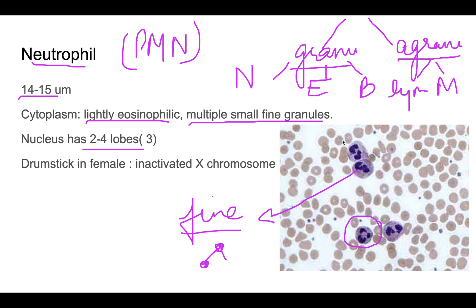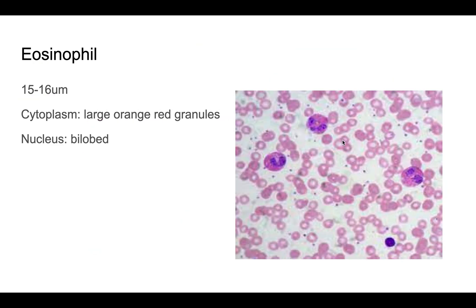In females, some neutrophils will have a drumstick-like appendage attached to the nucleus, known as the Barr body. This represents the inactivated X chromosome and is seen only in females. Now, moving on to the eosinophil — the eosinophil is slightly larger than the neutrophil.